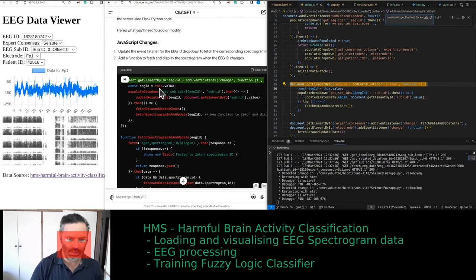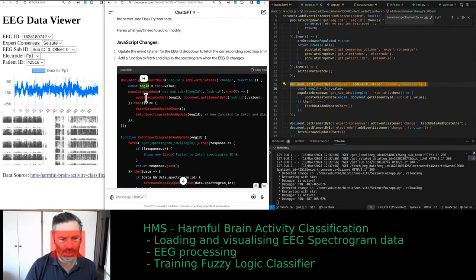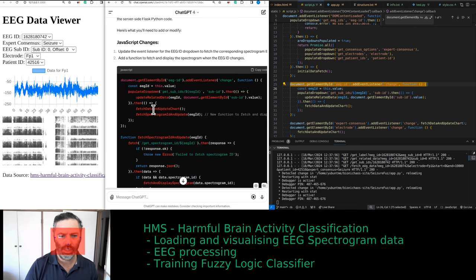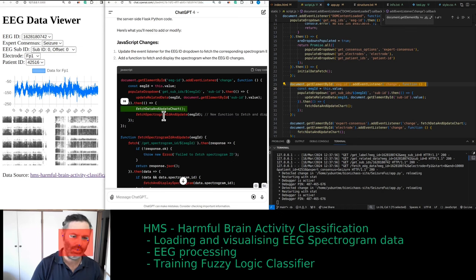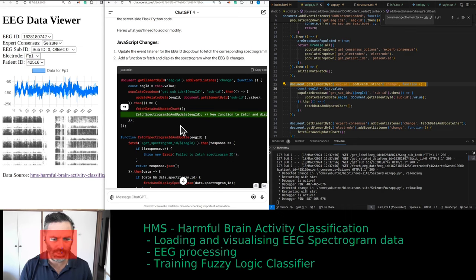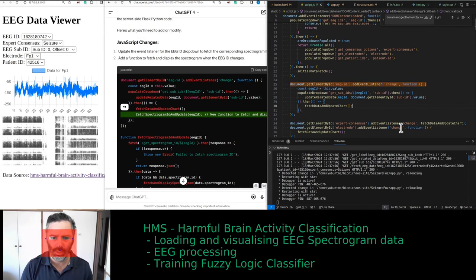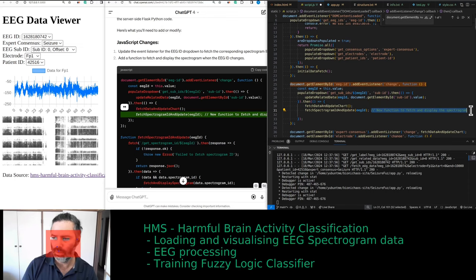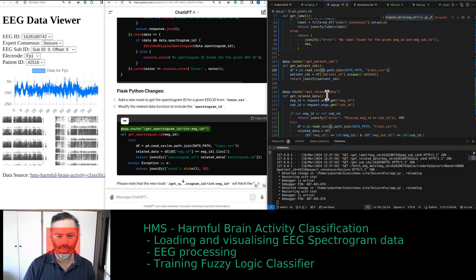We already have the EEG ID value in our JavaScript code. This is the new function to fetch and display the spectrogram — fetch, update chart, and fetch spectrogram ID and update.